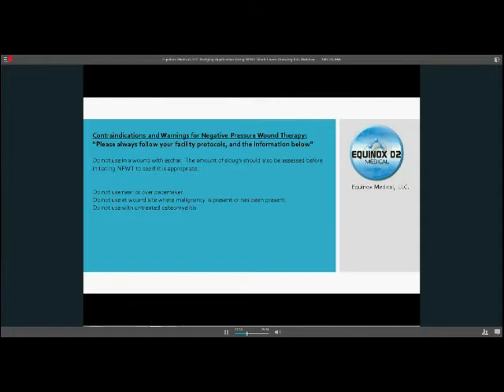be used. So it's important that if there's eschar present in a wound, you wouldn't want to put negative pressure on. What you would want to do is be able to get that taken care of first, whether it be sharp debridement by a physician or some type of chemical debridement, something like that, so that you're starting with the cleanest wound you can.